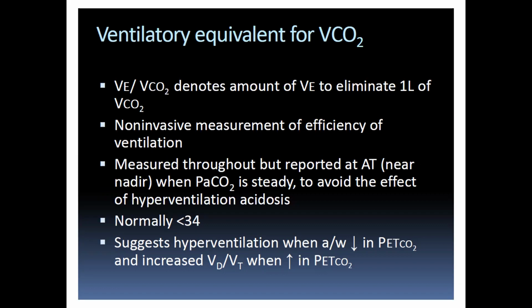On the other end, even ventilatory abnormalities. If you have COPD and your minute ventilation goes up, your frequency of breathing is increasing, right? So you can start developing air trapping, and you're going to have more ventilation perfusion mismatch.